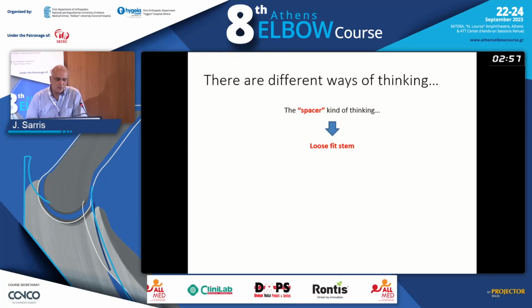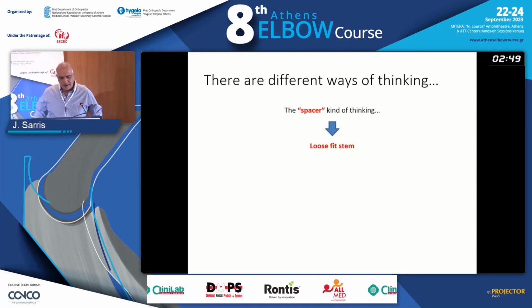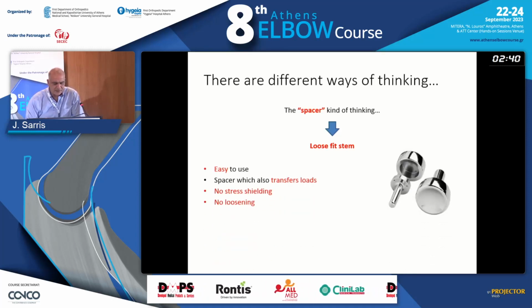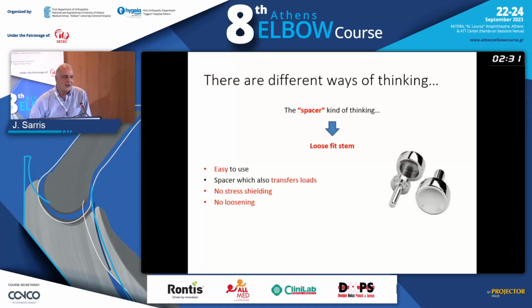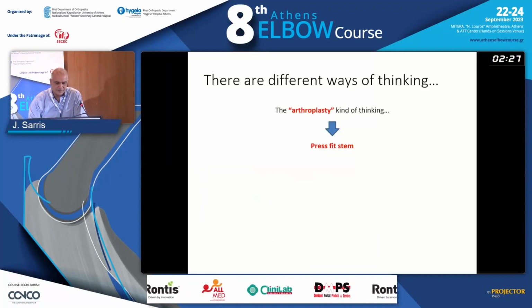So there are different ways of thinking, because we say that the most common complication is stem loosening. There are two ways of thinking. The spacer kind of thinking, with loose fit prosthesis, easy to use, the spacer will also transfer loads. There is, of course, no stress shielding, no loosening, although we'll see from the papers that we have lines of lucency even in the spacer kind of prosthesis.